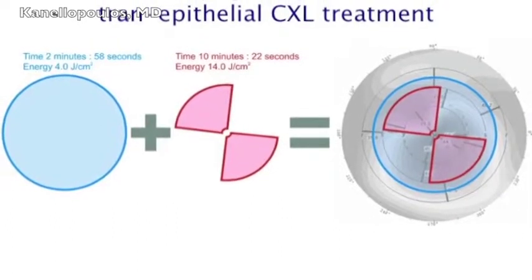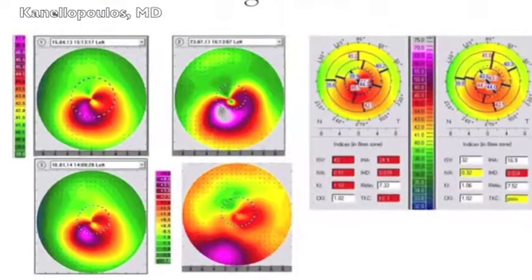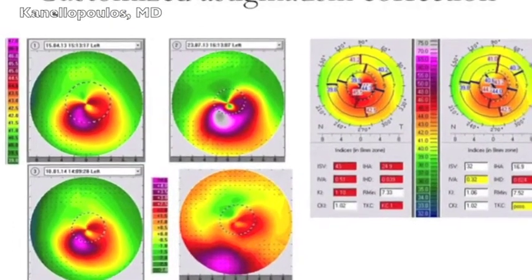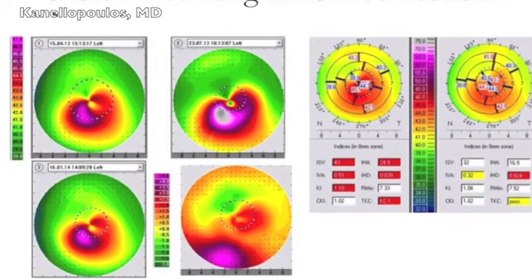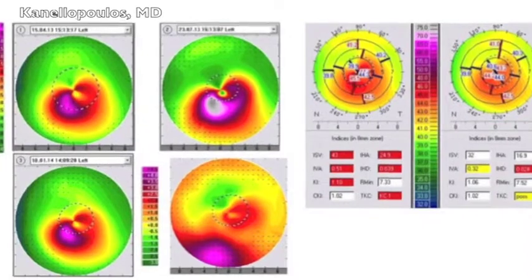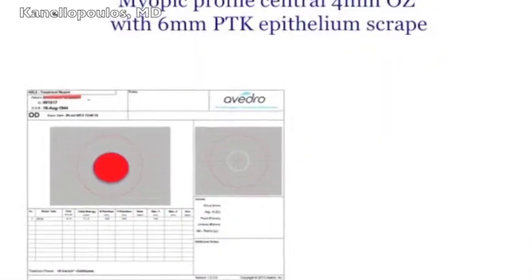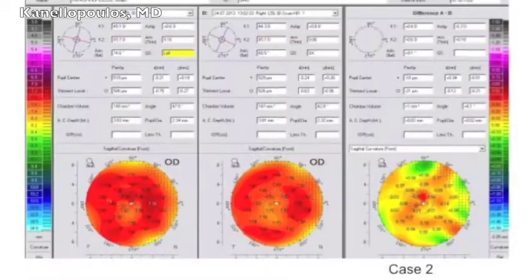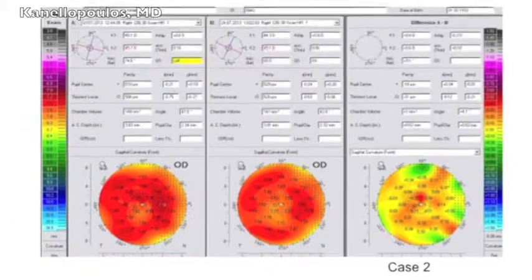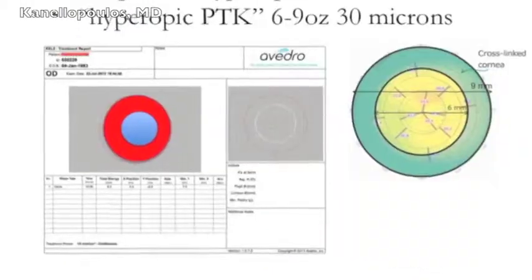This is the standard treatment and the astigmatic treatment on the flat axis, and results top left keratoconus, right next to it progression, and on the bottom after PiXL treatment and dramatic improvement on the right of the topometric indices. We'll go into myopic treatments, and these are 7th month data. Before on the left, middle, after, and the change on the right. So myopic correction only with cross-linking.